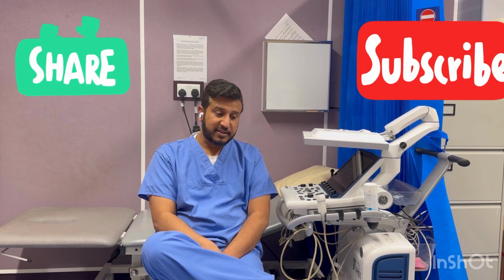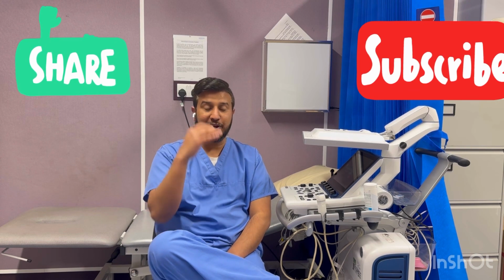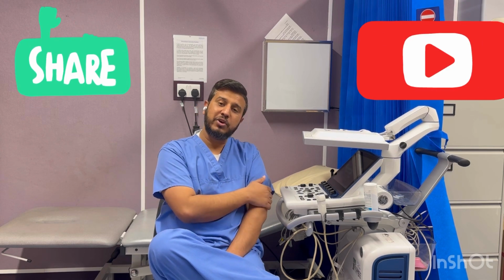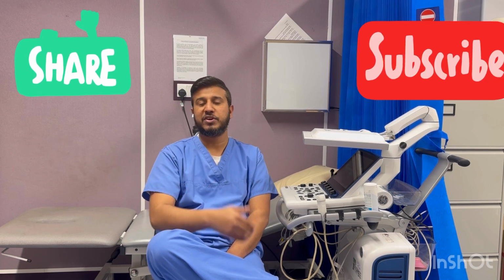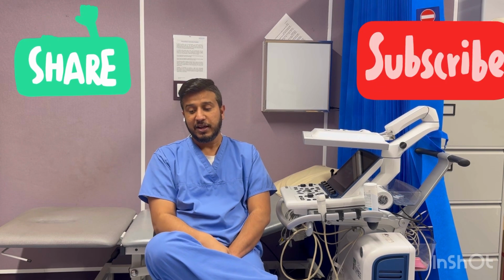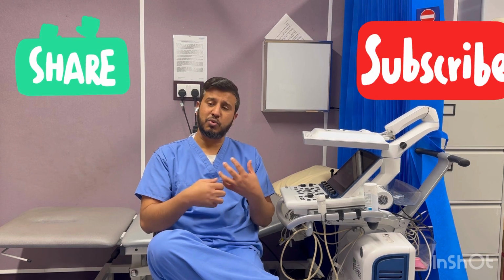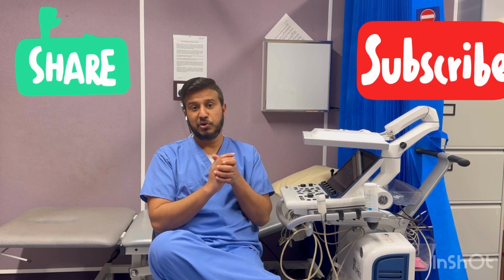The other thing is that regarding the imaging, I know in the last channel, whoever was following me, we went into very much details of the imaging. Today I'll just explain how we can get the imaging. Definitely you will be in the echo lab, so you will learn it from your seniors, okay? But if you have any questions after that, or you are struggling to get any image, you can write it in the comments and I will try to help. So today I will give you a quick idea about the imaging, like how you should be doing the imaging, where your probe will be, and how you will be doing the rest of the things.